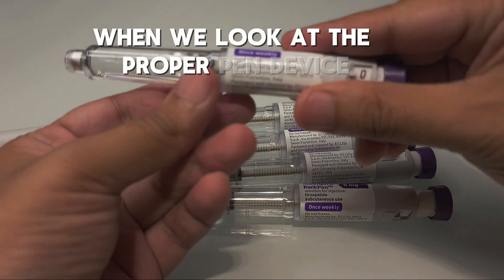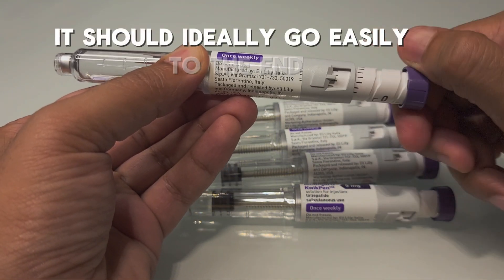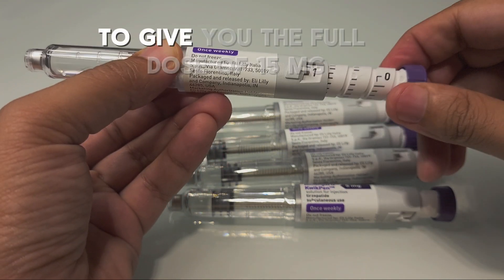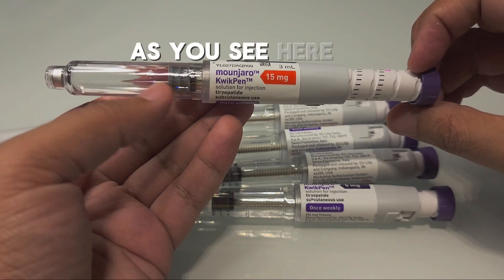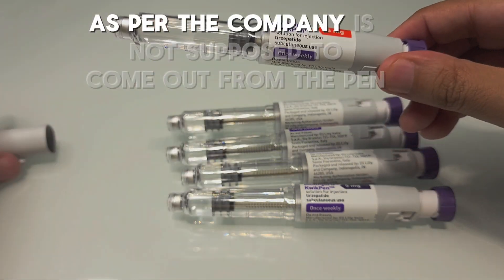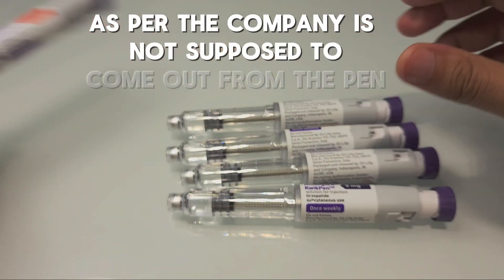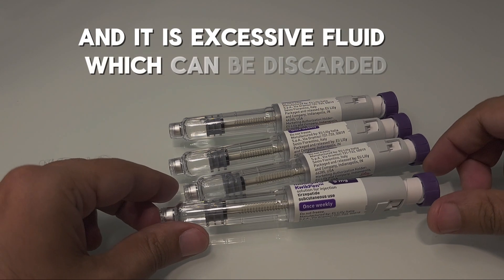When looking at a proper pen device, it should ideally go easily to the end to give you the full dose of 15 milligrams, as you can see here. The last leftover fluid, as per the company, is not supposed to come out from the pen — it is excessive fluid which can be discarded.